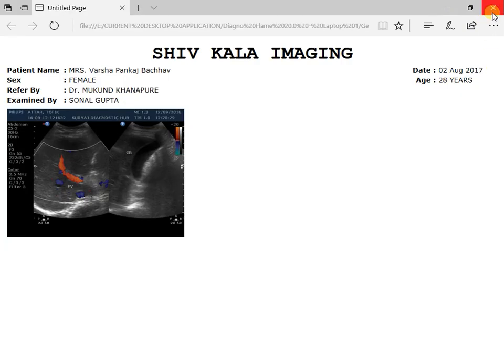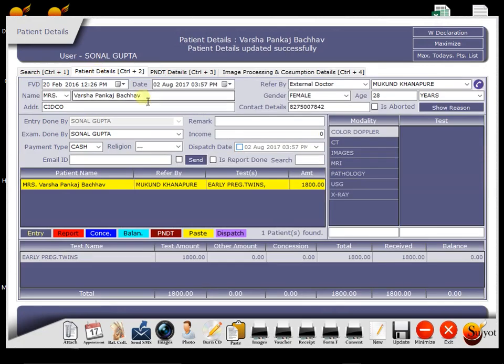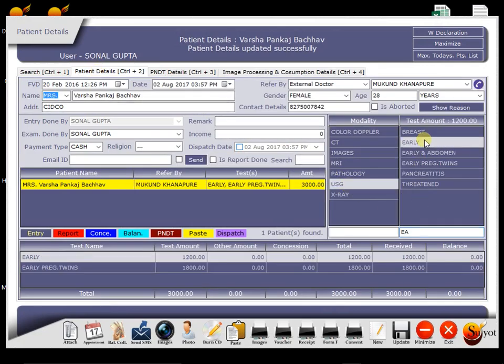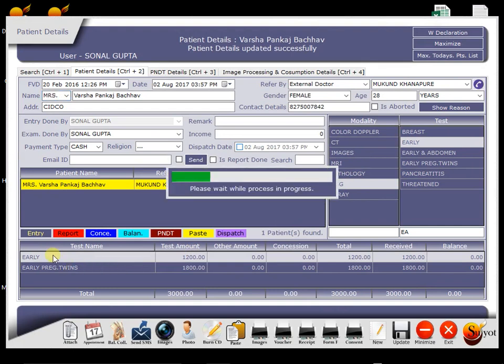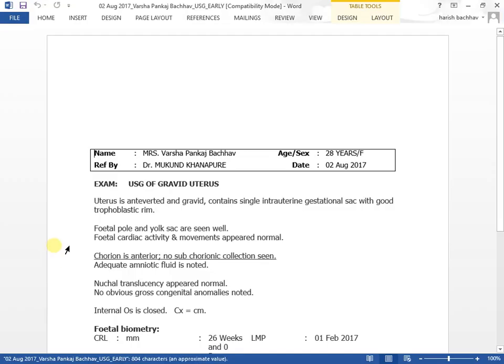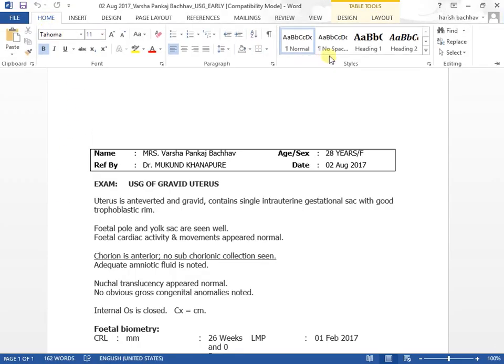Now the next thing is to generate patient report. For that, we select modality. Then report formats will appear for selected modality. We choose appropriate report from this list. This report template will get opened in Microsoft Word with all patient info with auto-calculated EDD and GA.